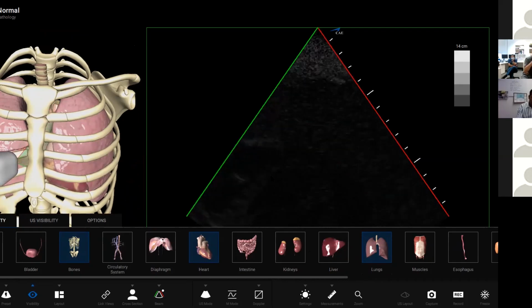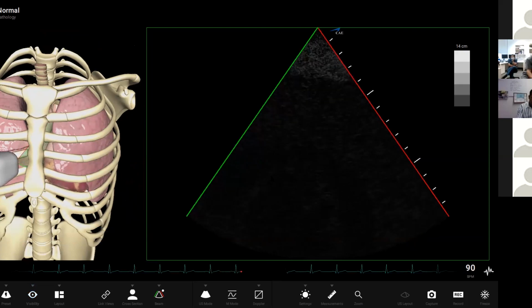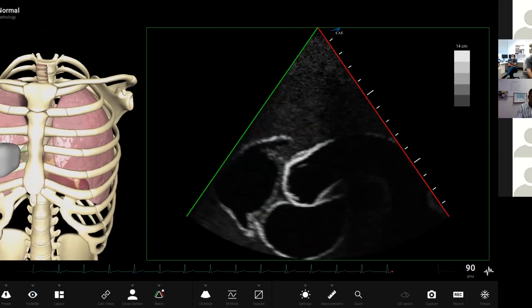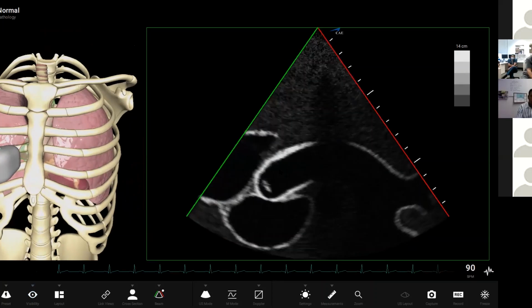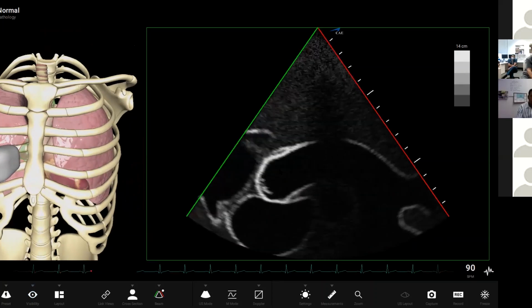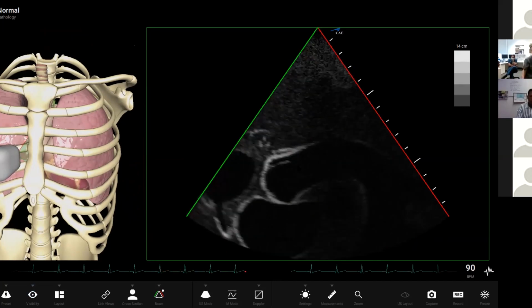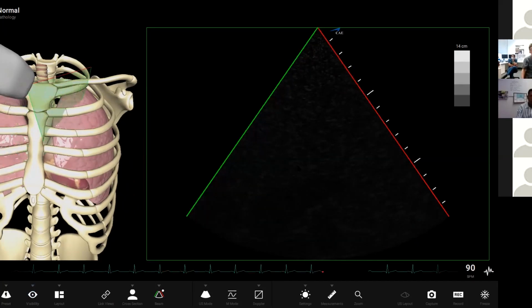Well, I guess we're often asked, what's the aortic root like? Because it's a very big problem if you're wanting to lyse STEMIs and things. And so sometimes you can't get it from left. So I've been trying to figure out what right looks like. But thanks for that. I find it pretty challenging.